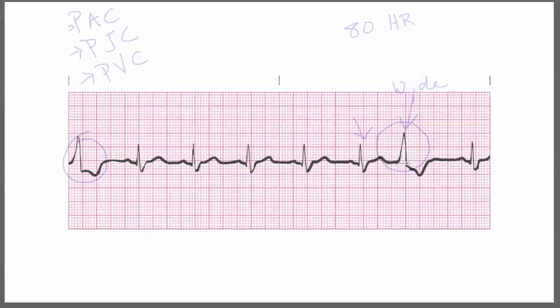Because it's wide and it looks completely different from the other QRS complexes, this means that it's coming from the ventricles. We also want to double check and make sure that we don't have a P wave — there is no P wave, and there is not. So this is definitely a premature ventricular contraction.